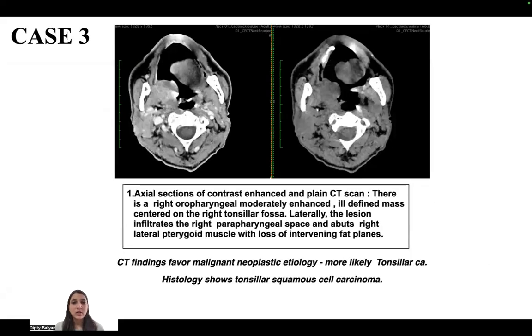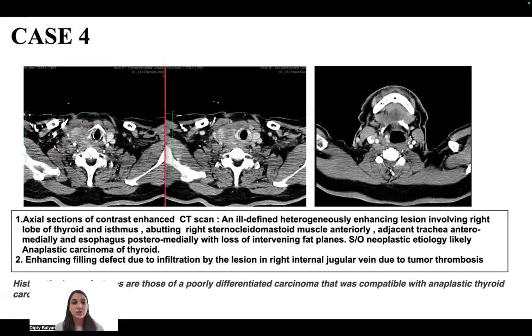In the third case, a right oropharyngeal moderately enhancing ill-defined mass is centered on the right tonsillar fossa. Laterally, the lesion infiltrates the right parapharyngeal space and abuts the right lateral pterygoid muscle with loss of the intervening fat plane. CT findings favor a malignant neoplastic etiology, most likely tonsillar carcinoma, and histology confirms tonsillar squamous cell carcinoma.